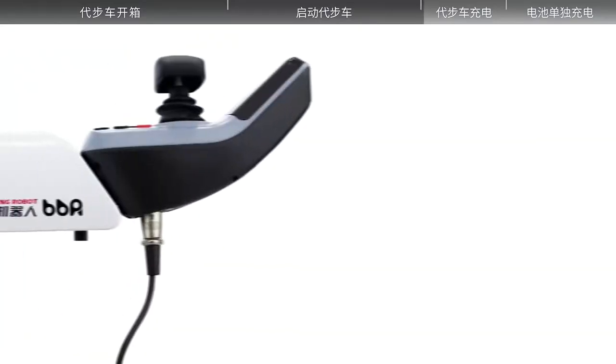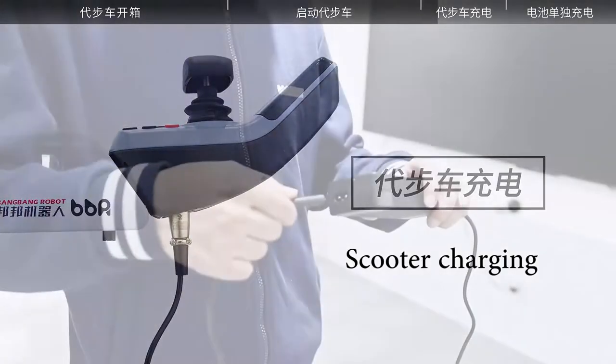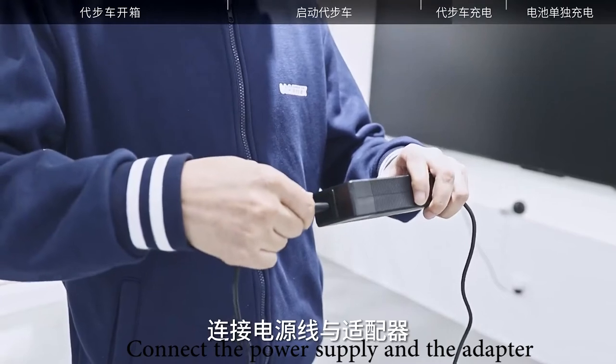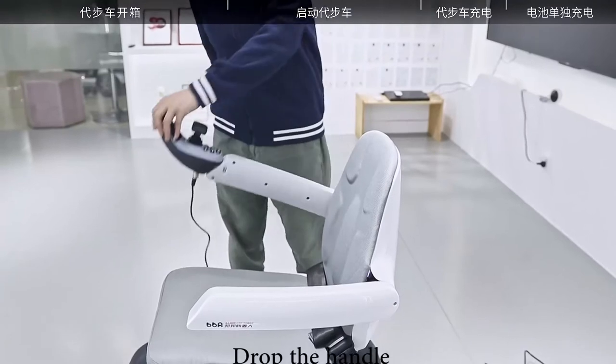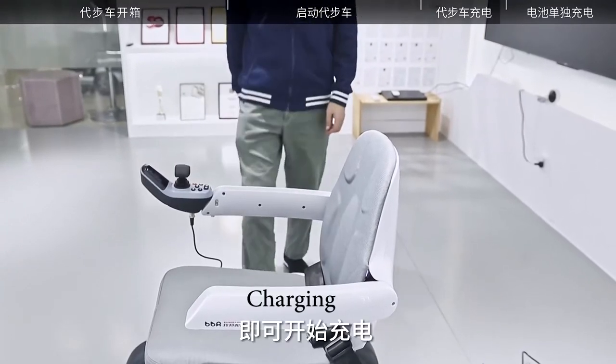The power mobility scooter charging. Connect the power supply and the adapter. Insert the plug of the charging cable into the socket under the control handle. Drop the handle. Ready to charge.